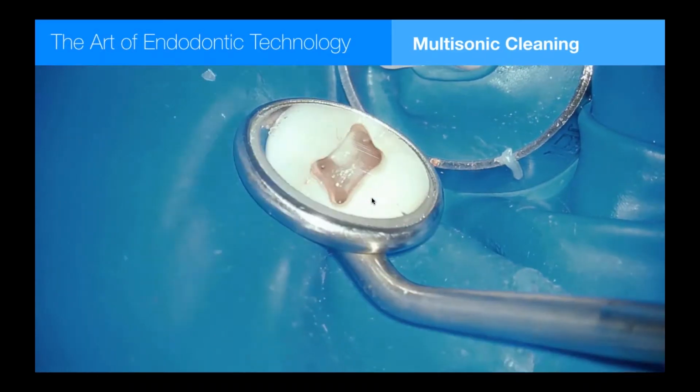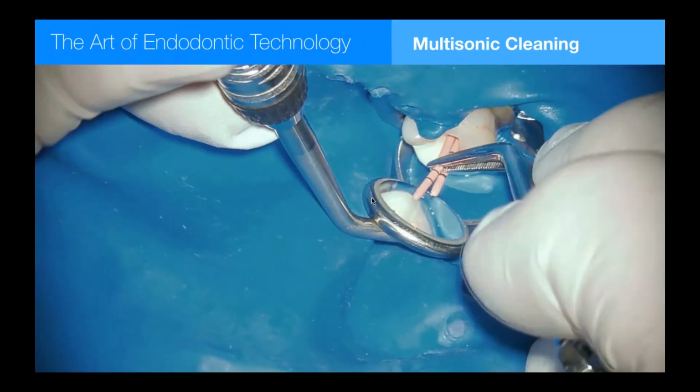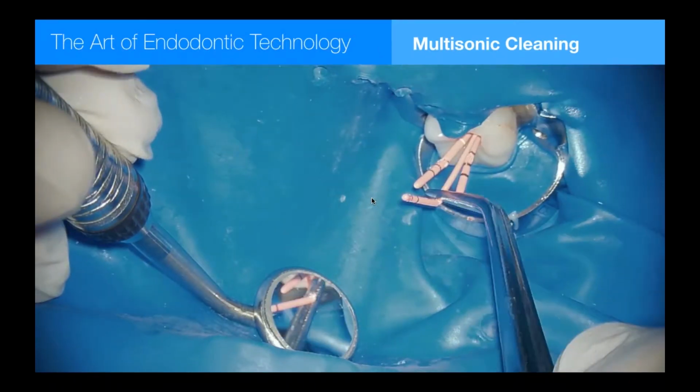Here is the post-op cleaning. You can see those orifices look super, super clean. I've never seen pulp chambers this clean in 38 years of endo training. So this is changing. Multi-sonic cleaning is changing a lot about what we do before and after.